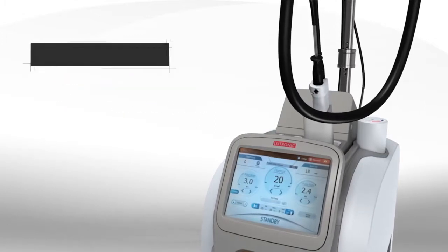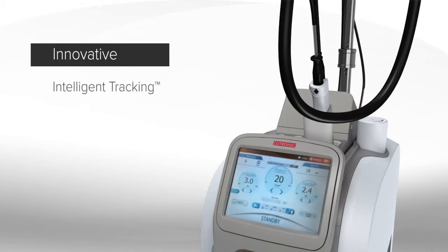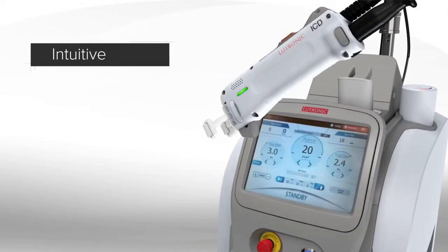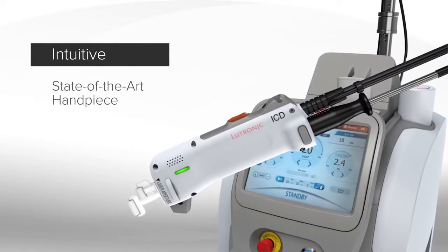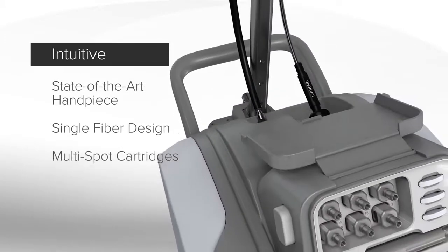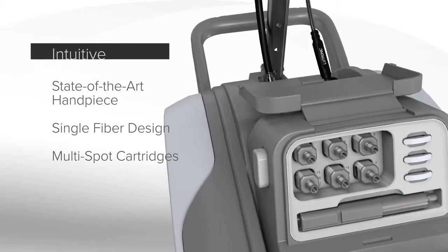Clarity 2 is innovative with its unique intelligent tracking and temperature sensing capability. It's intuitive with a state-of-the-art handpiece and single fiber design supporting smart multi-spot cartridges ranging from 2 to 25 millimeters.